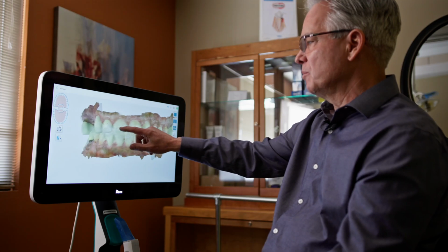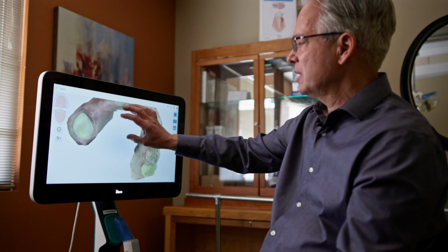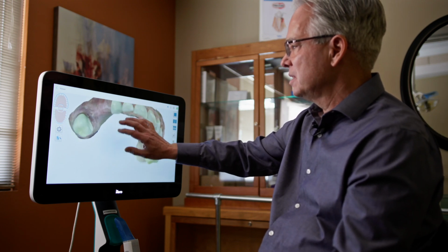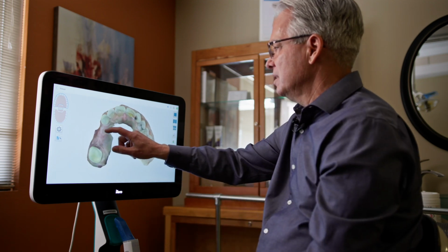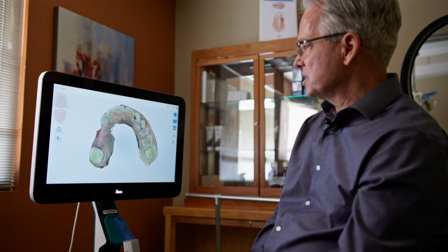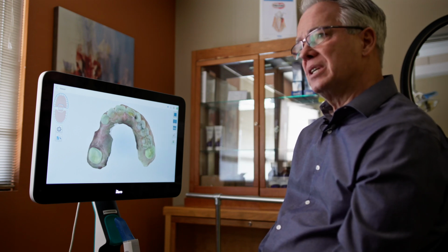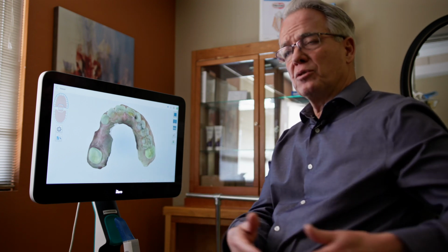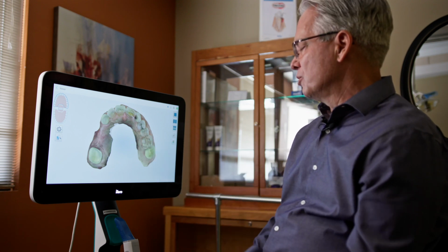So we can not only manipulate the image by rolling it around like that, I can isolate and say, you know what, I kind of want to see all the top teeth. So I can rotate this down and say, okay, this is what the patient's teeth look like, and they can't see way back here. But now when I'm doing the examination, I'm not looking directly in the mouth just yet, because I can see more here, so I can communicate more directly with the patient.